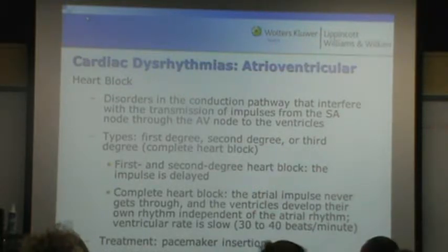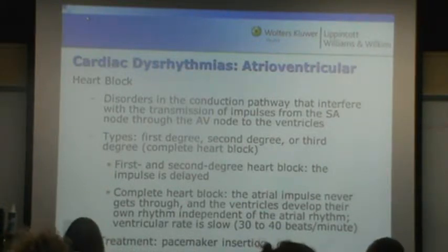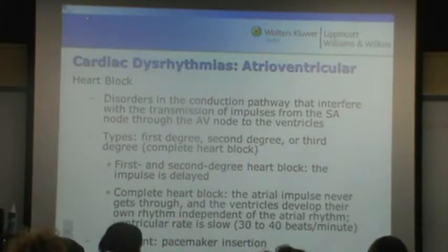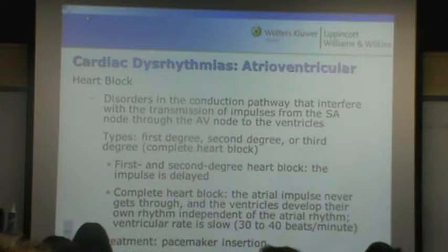And don't pay attention to that part. That was left over from one of the previous rhythms. The heart rate is 127. Okay. So I would say sinus. Absolutely. The sinus tach. All right.